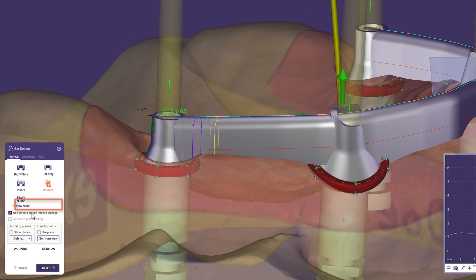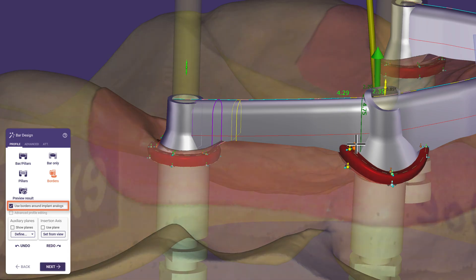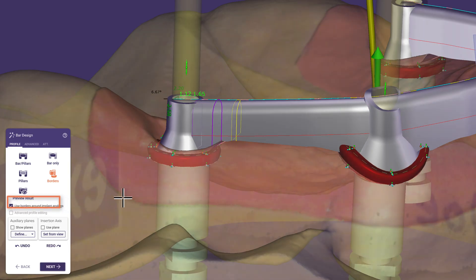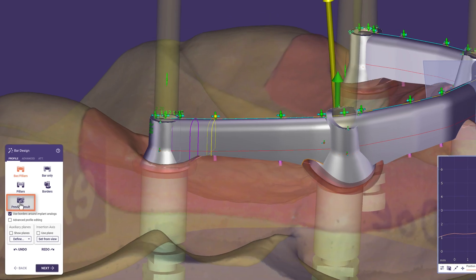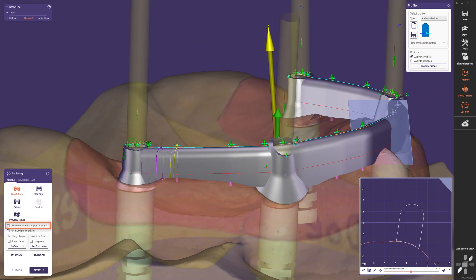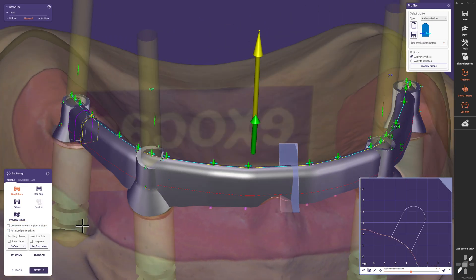Another option is the use of borders around implants. These areas can be activated and edited individually in the first tab. By clicking the preview button, we can see that the material intersecting these areas will be removed around the implants. Let's uncheck the checkbox to leave it as it is.